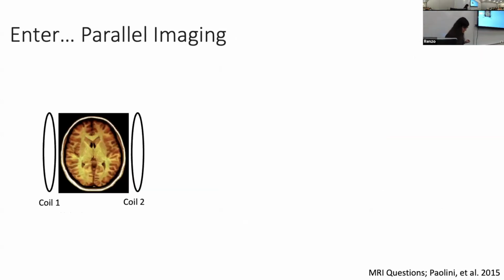So this is maybe a good, maybe bad choice of words, but in parallel to the idea of going faster in MRI, we've also for a long time been working on engineering projects called parallel imaging. Parallel imaging is the idea that we can actually read out spatially from different places in an MRI coil in order to increase our signal to noise.